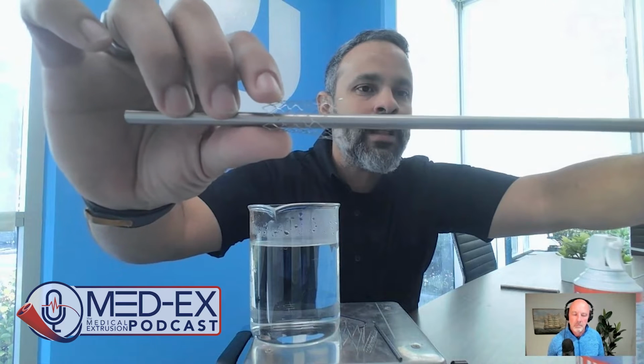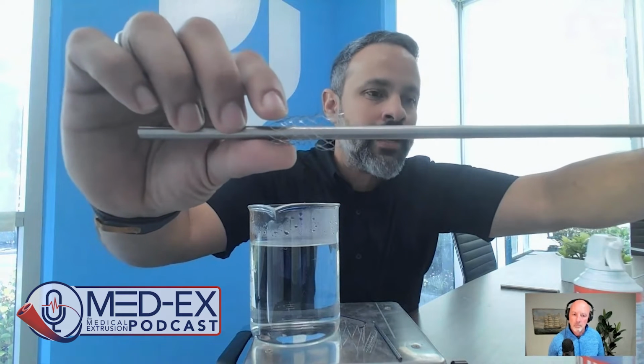We can even make the metal behave completely different by selectively heat treating some areas. That means that specific location will have a look and feel completely different than the rest. For example, the designer wants this top part to anchor on a vessel harder than on a bifurcation or something like that. He can change it, or he can say, hey, I want the stiffness of this area higher than the other. So we can selectively heat treat only that area. So the feel of the device will be different. That's why it's so important to educate customers, because we want to make smart devices when you can control how this metal behaves in the body by doing different techniques of heat treatment, laser processing, electropolishing, you name it.